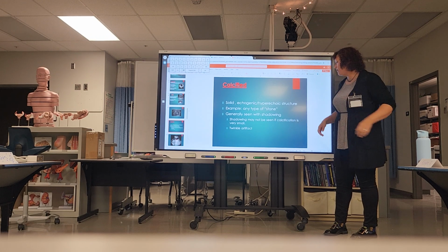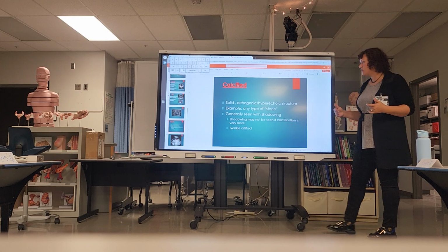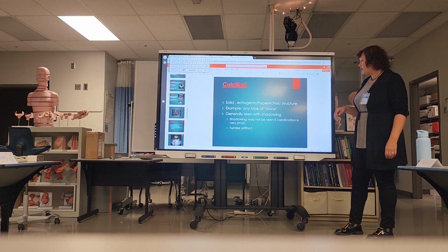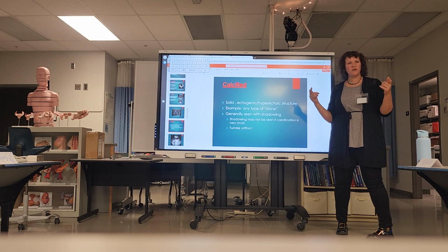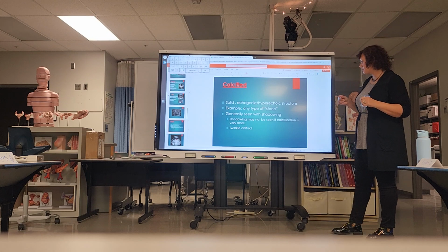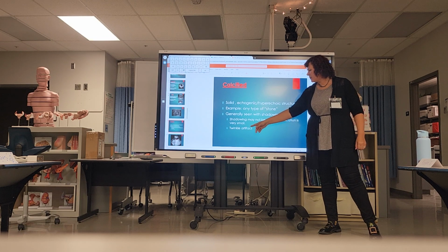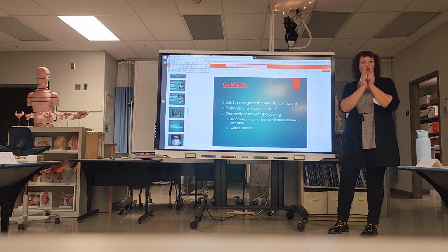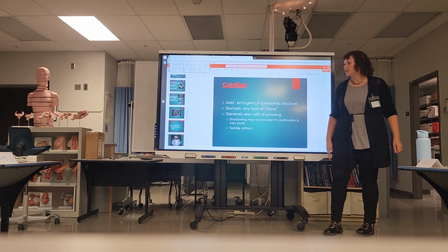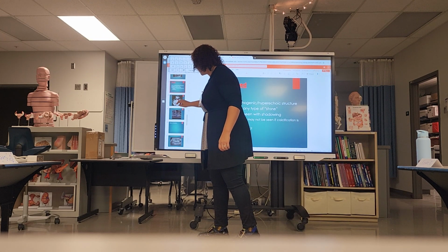And most of the time, there will be shadowing underneath. So there's going to be shadowing posterior to our bones, posterior to any kind of kidney stone. But not every kidney stone will have shadowing. It depends on how old the kidney stone is, how dense it is. And especially in the kidneys, if you put your color box over the kidney stone, it'll give you an artifact called twinkle artifact. Okay, I'll show you twinkling in a second.